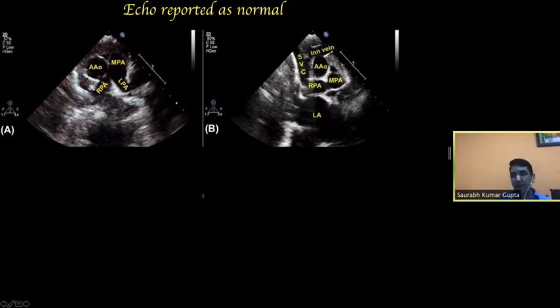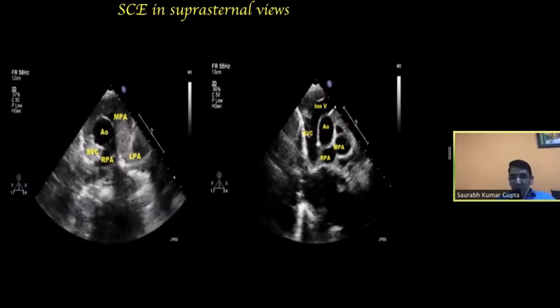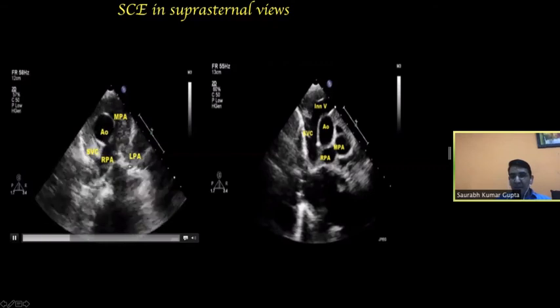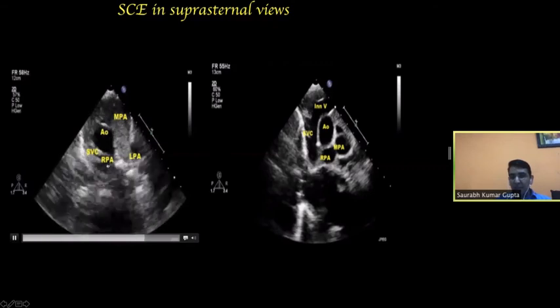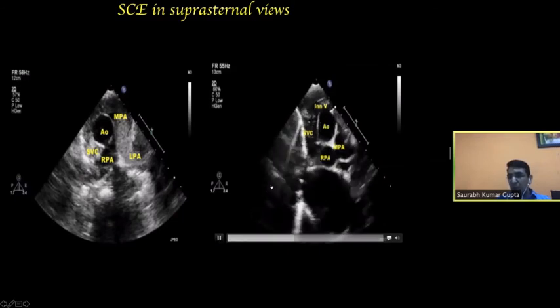But then what is happening? Now, look at this. So we did saline contrast echocardiography. And I think some of you would have already picked that the saline is already retained within the LPA and nothing goes in the RPA. This becomes further clearer on this injection.